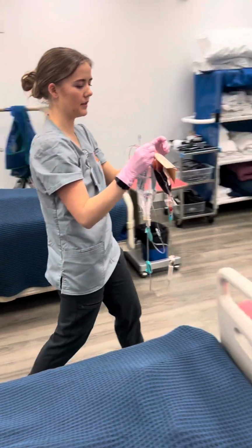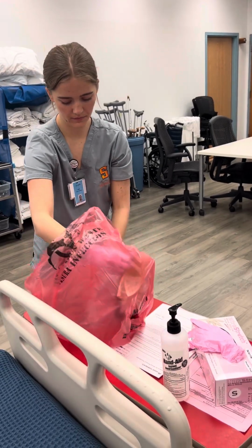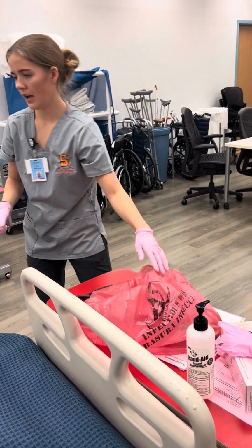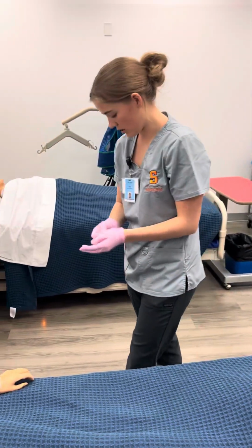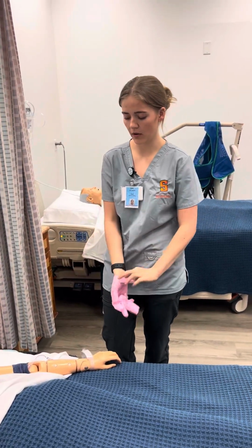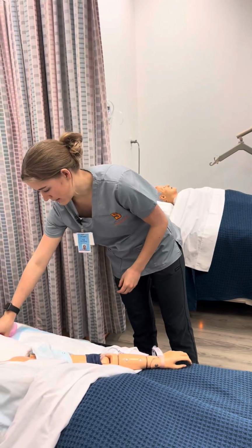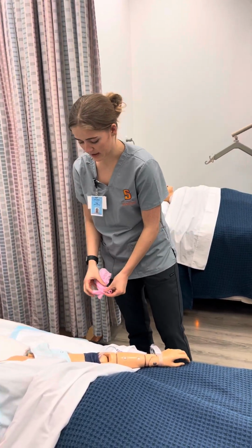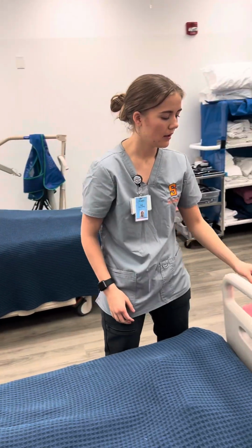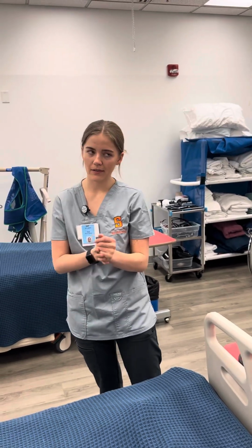And I'm gonna place everything in my red bag. And then I'm just going to educate my patient on some signs and symptoms of delayed reactions and just let them know what they might expect and what to do with that. And then I'm also going to obtain a set of vital signs an hour afterwards to make sure we're still doing okay. And then, yeah, so now I'm going to go document it.